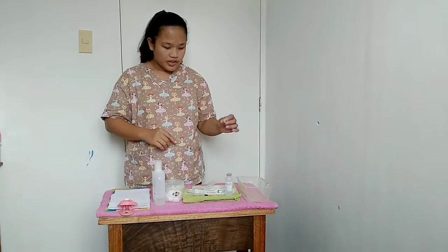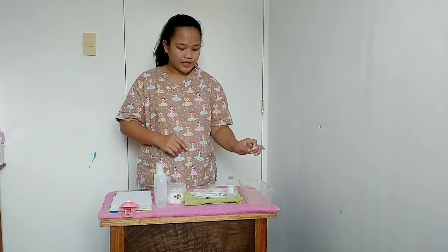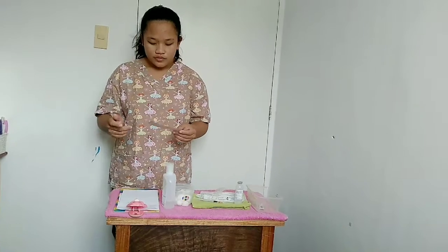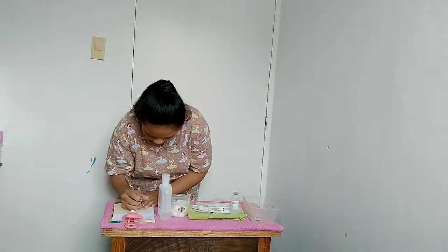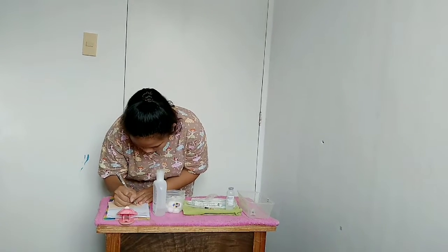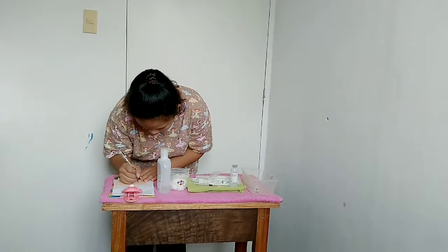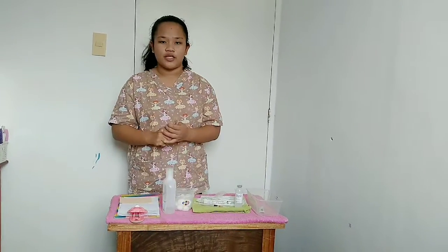Now discard the aspirating needle into the waste receptacle. Do not forget to take note of the name of the drug and the dosage so that we cannot forget it.